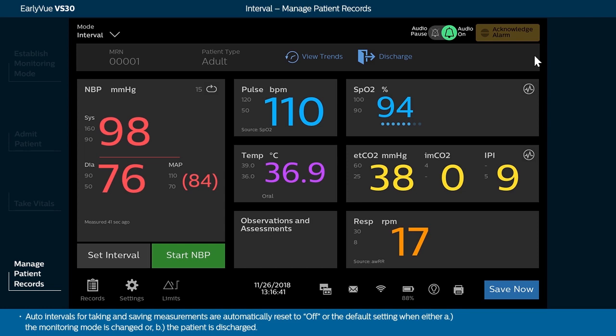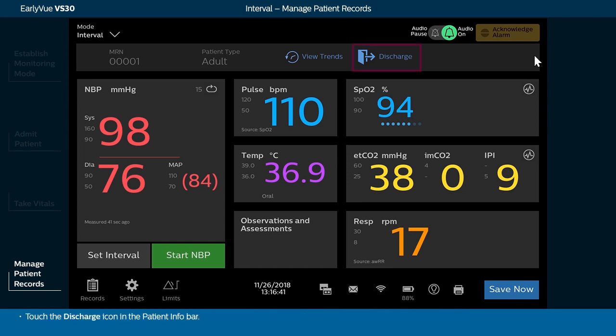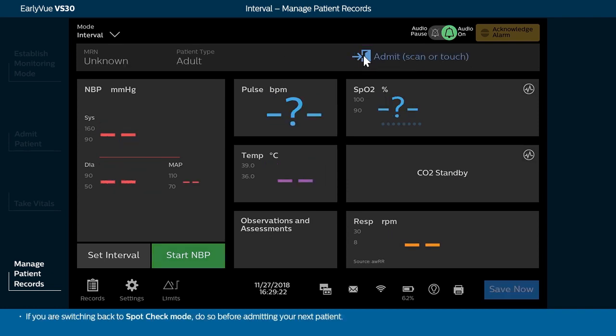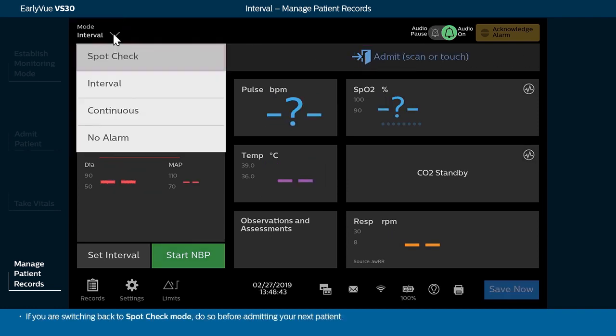Measurements continue to automatically be saved to a patient record when either NBP Auto Interval or Save Measurements to Record Interval is set. Auto Intervals for taking and saving measurements are automatically reset to Off or the default setting when either A, the monitoring mode is changed, or B, the patient is discharged. Touch the Discharge icon in the patient info bar. If you are switching back to spot check mode, do so before admitting your next patient.